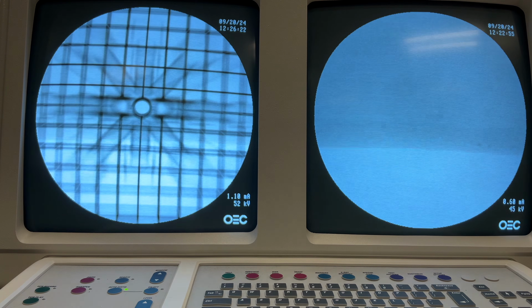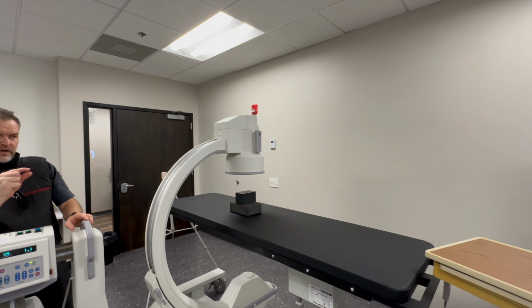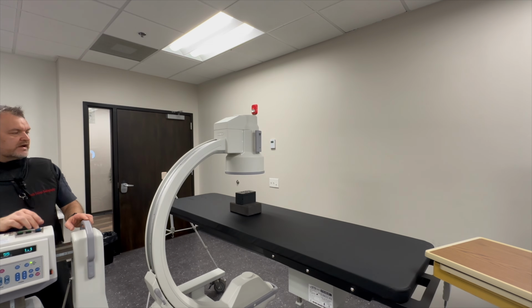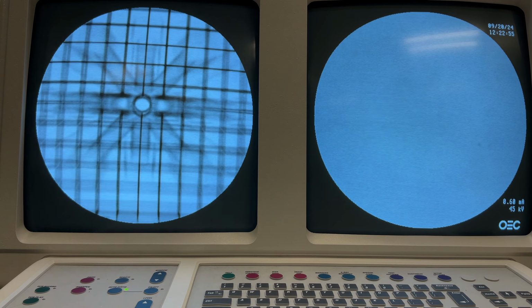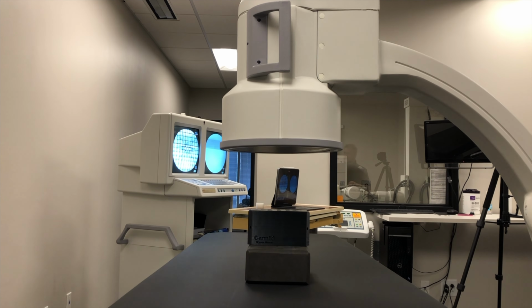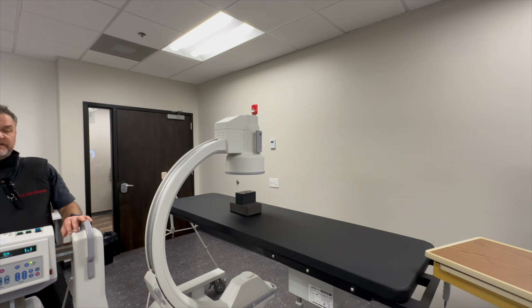And there we go. Now, I can see on the left, or on the bottom edge of the screen, which is the left-hand side of where I'm standing, the foot end of the patient, I have a little bit of a double shadow there. So that tells me I have a hair of tilt. Let's see what happens there. That made it worse. So I take that tilt off and then apply it a little bit more the other way. And here, I'll take a picture without motion. Now we can see that we have demonstrated that perfect circle nice and open and at its fullest.